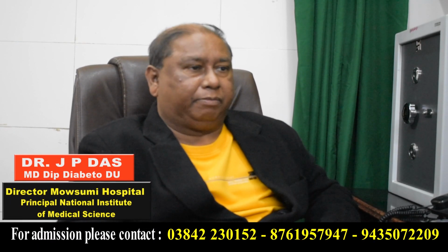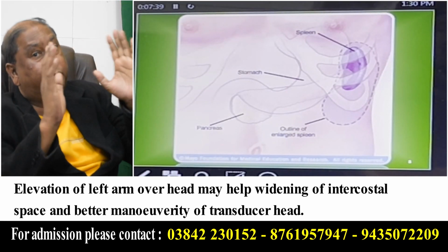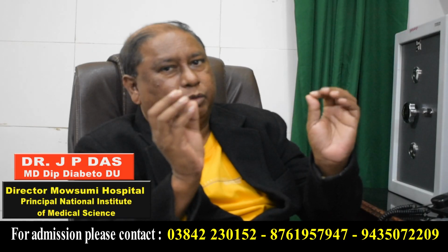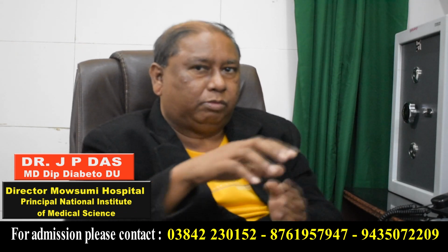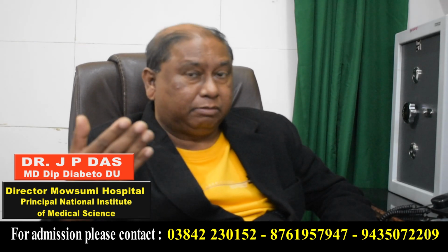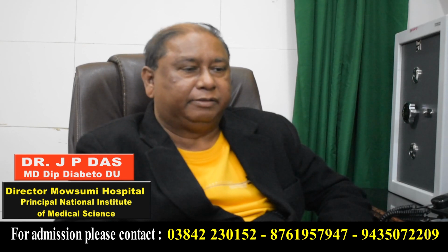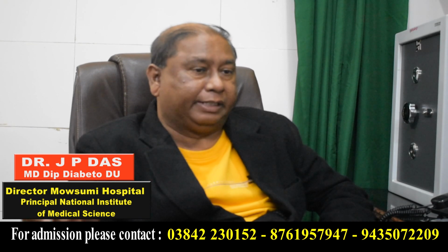Elevation of the left arm: if the patient elevates the left arm, the ribs will be diverted. So more space would be there and your probe will get more space to send the beams and you can see the spleen more clearly and the transducer head will get more space.